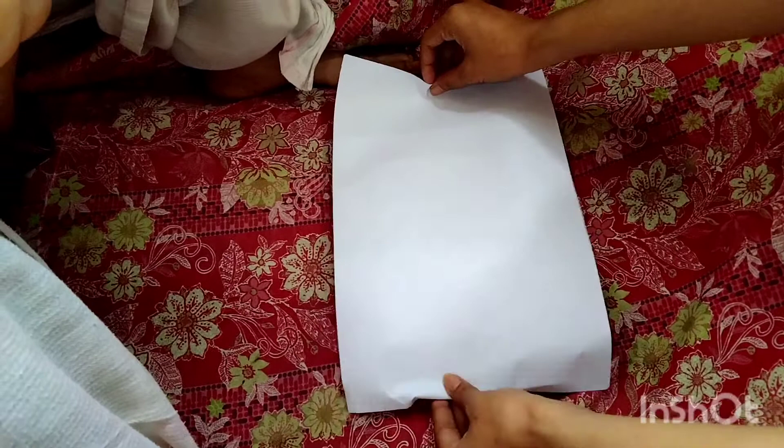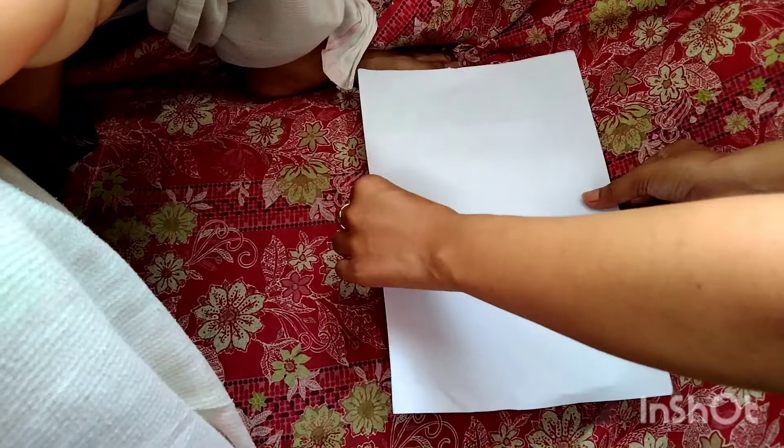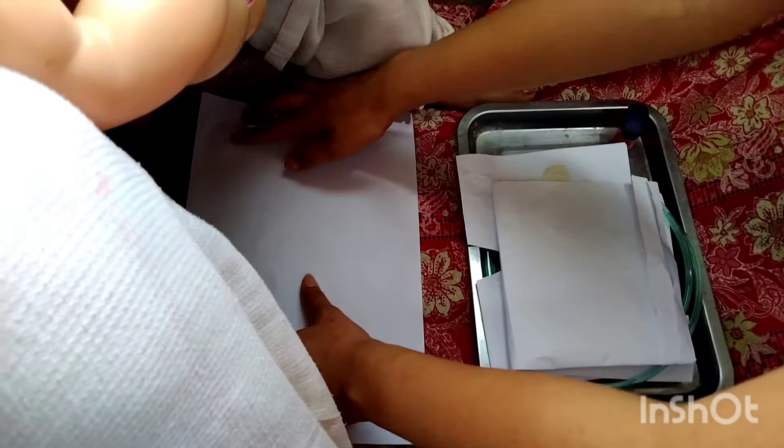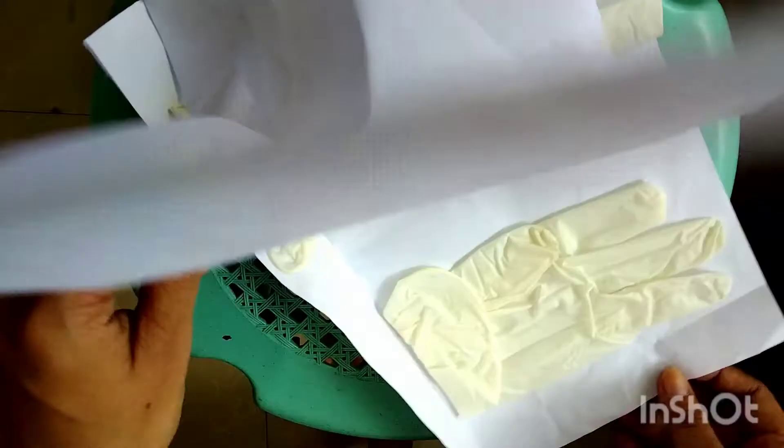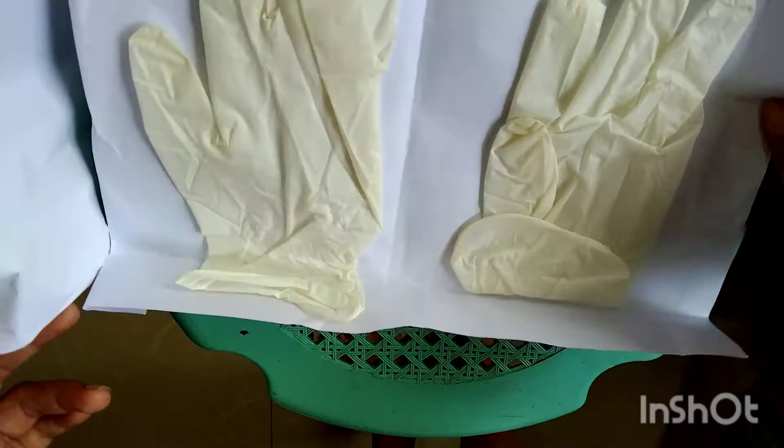Next, in opening the sterile pack: grasp its corners and open it with care, touching only the underneath sides and edges. Bring the edge of the cover under the buttocks if able. This provides a sterile field and prevents transmission of microorganisms from the table or work area to sterile supplies. Next, let the doctor open the pack of sterile gloves and put on gloves, allowing the doctor to handle sterile supplies without contamination. Observe sterile technique in offering the pack of towel for draping to help maintain sterility.